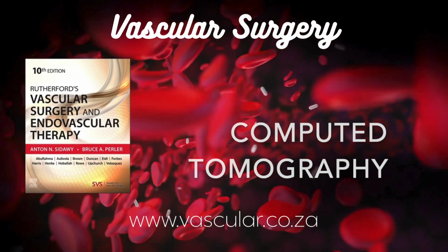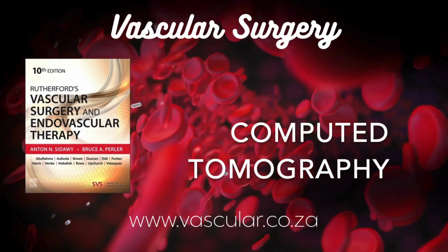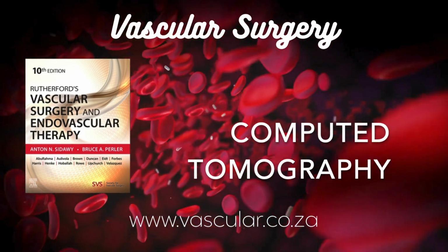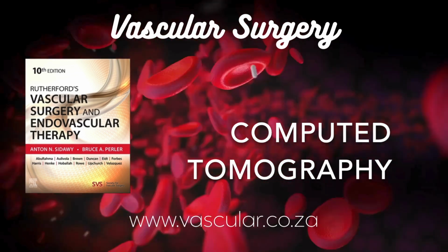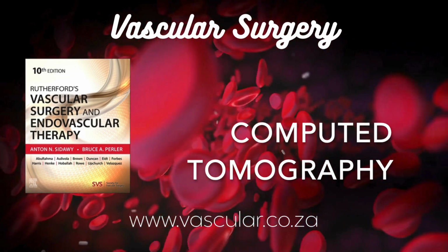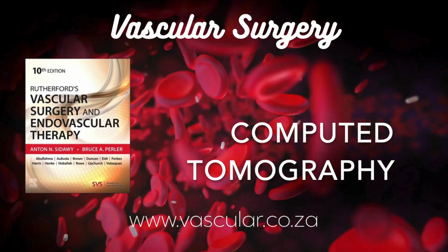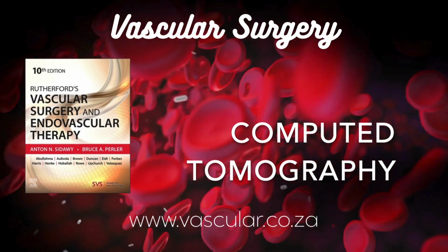Good point. Yes, dense calcium often falls into the same HU range as contrast, so visualizing just the vessel lumen can be tricky if there's a lot of calcification. Sometimes software tries to electronically remove overlying bone. Like skull around brain arteries. Right. That can be done semi-automatically or manually, but removing calcium within the vessel wall itself without removing the contrast is much harder. Usually the calcium is included in the 3D view of the vessel.